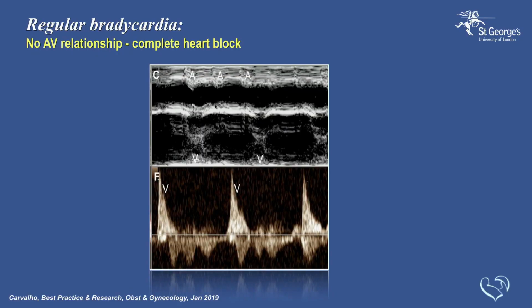And that's how it looked on a still picture: the atrium here is regular, and that ventricle has no relationship. See, that one kind of coincides with this, precedes that one, so you need to try and time it, because sometimes this may still be a 3-to-2 block or a 3-to-1 block. So if there is any conduction, even if the heart rate is slower, it's better, because at some point there is some synchrony between atrial and ventricular contraction.